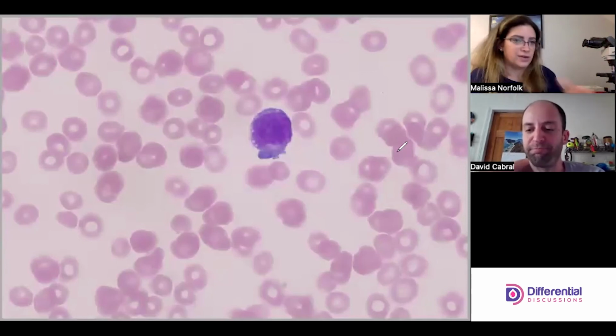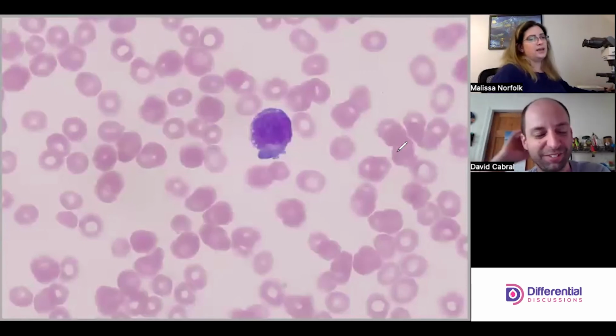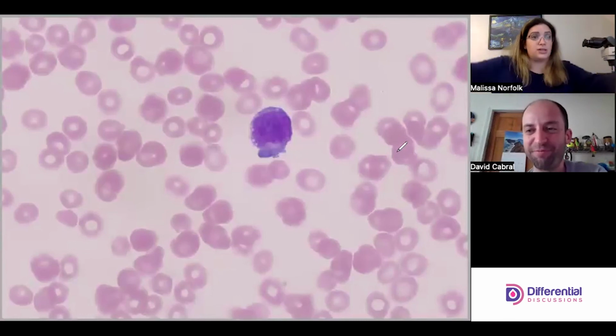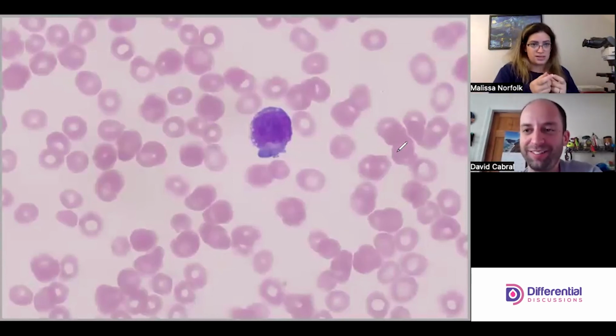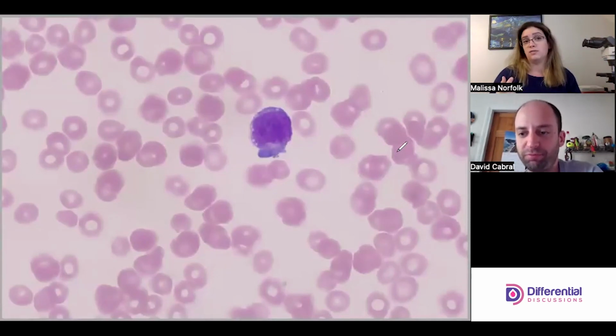Right. And I think that is hard to understand as a concept too when you're first learning about malignancies. Because you think malignancy, they're all malignant. Well, no, it started from one clone and then clonally expanded. So the numbers you're seeing are basically the same cell that just keeps dividing. Like this guy took over, but this guy over here is not malignant and he's allowed to mature. He's going to mature how he should mature. And this guy is going to clonally expand, reduce apoptosis, get rid of the whole issues where they need to regulate themselves. Whereas this guy still needs to regulate himself. Right. Yep.